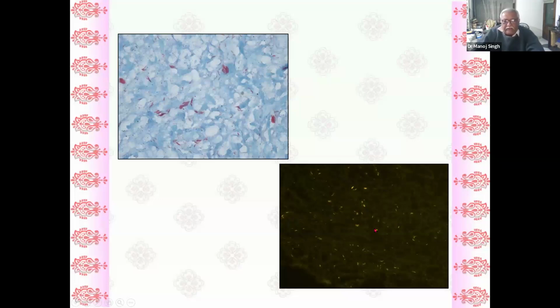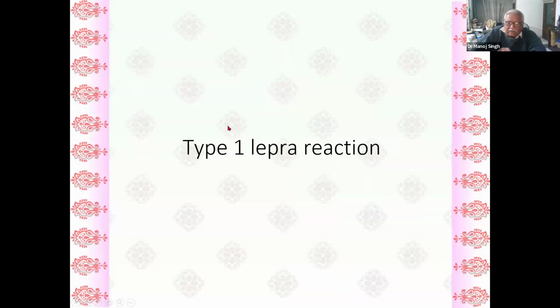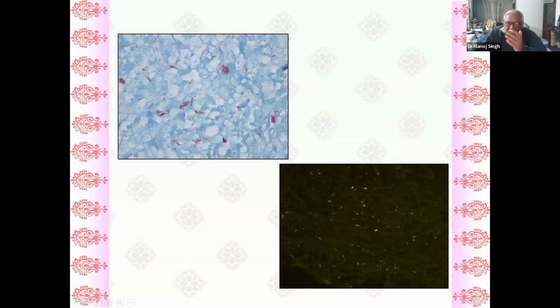which, perhaps the pickup rate here is better than here, because at times the problem you have in acid-fast staining is that the background stain, the blue, is a little dark. So it becomes a little difficult to make out the red of the acid-fast bacilli versus the background stain. And that is where this dark background is perhaps better for screening. But of course, a matter of expense and having an appropriate microscope and so on.